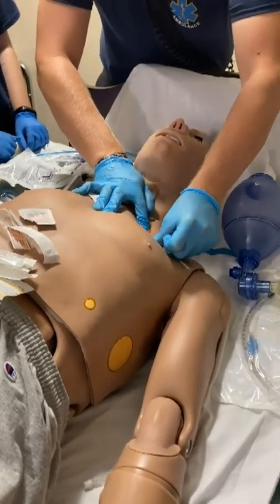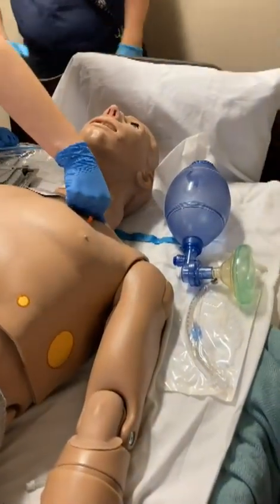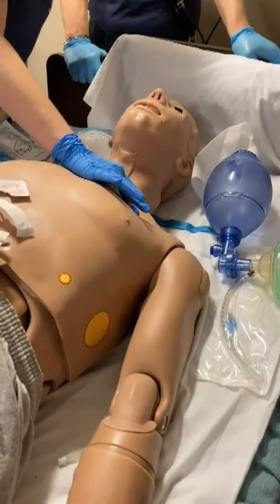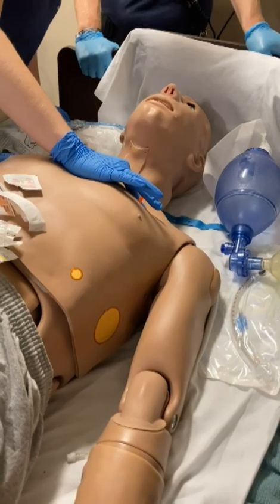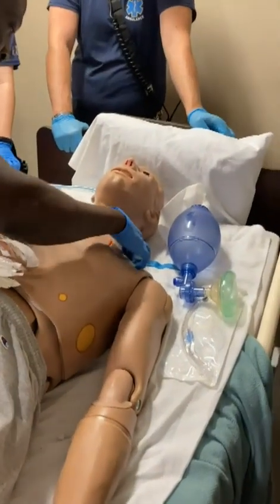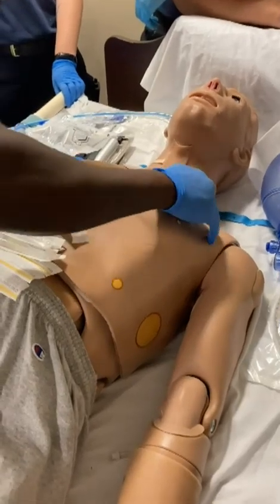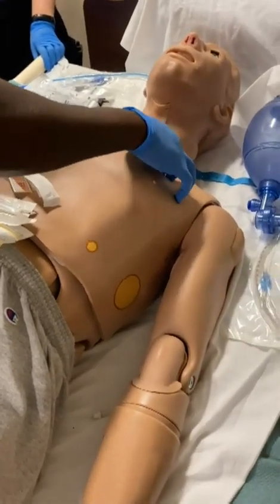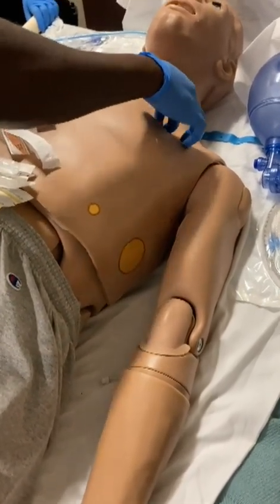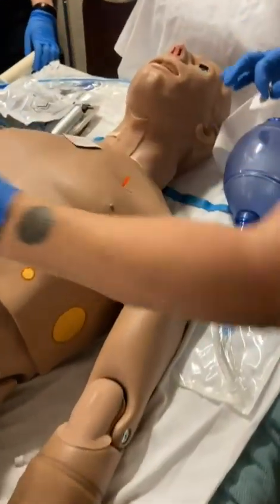We'll see how many people agree. So there's your one divot, two divot. Okay, let's see what we got here Josh. It looked good, it felt pretty good.